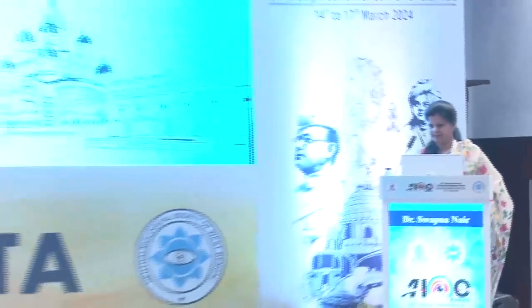Very nice videos. I just had a couple of queries. One was regarding the vertical vault, Swapna. In spherical ICLs, it may be a good idea to try and see if you can put it oblique or vertical before exchanging it.